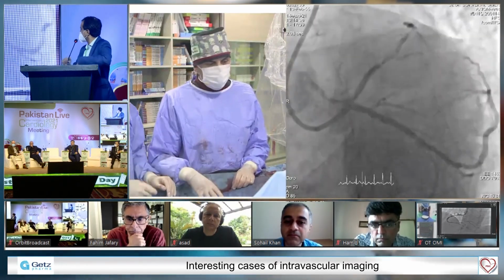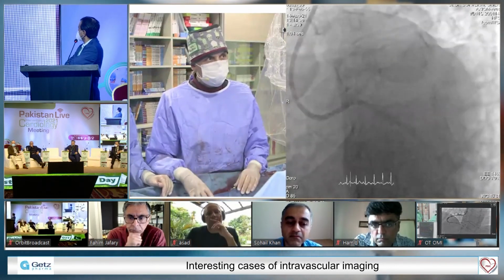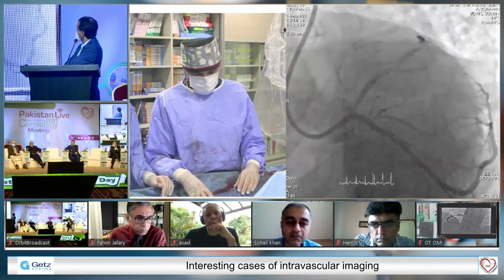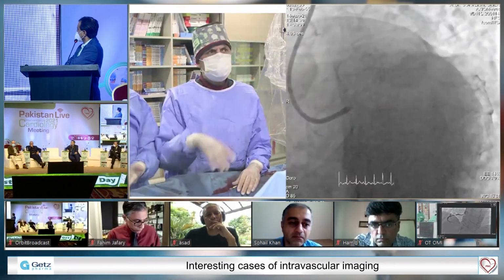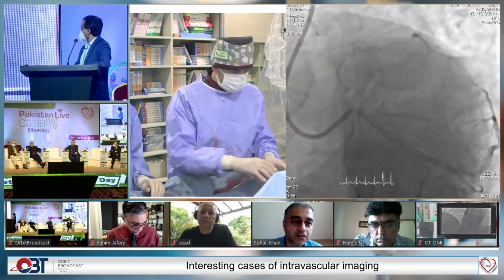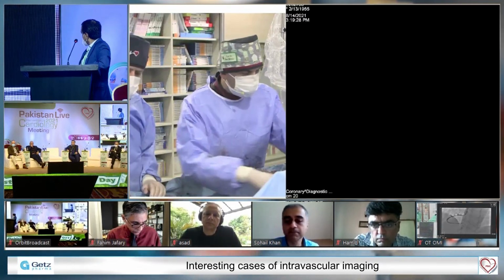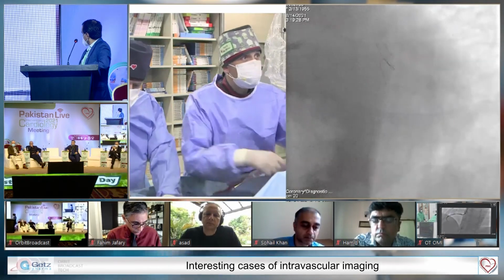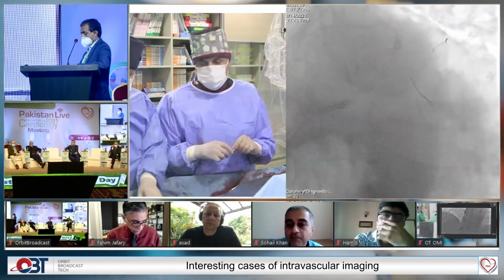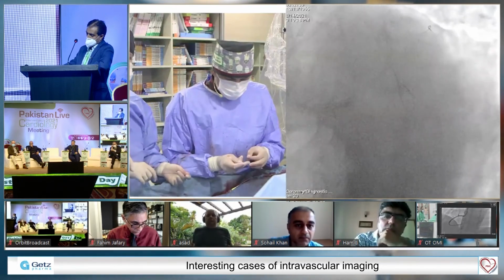I will do IVUS anyway, to see the result and how much I could go. Let's do IVUS and then decide. But how about the diagonal? I think you should do a POT here and then try and wire the diagonal. Okay, let's do IVUS first, because I'd like to see exactly which size I have to use for POT or post-dilatation. Let's do some IVUS.